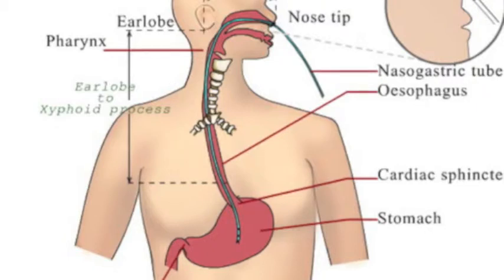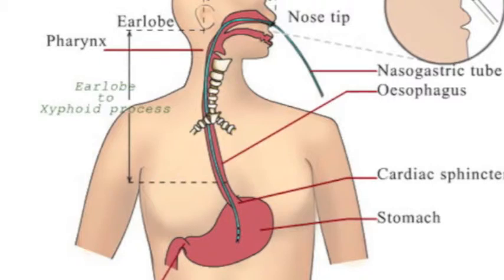And usually someone who is getting a gavage has a problem with the upper GI tract. They've had surgery, and the physician has determined that this person has a problem with absorption. So there's a Levine tube put down, and they get their feedings that way. Besides having a tube, the person may have a PEG tube, and you're taking care of the person as opposed to an esophageal gastro tube. The person may get feedings through that.